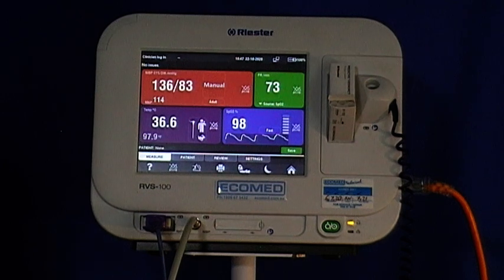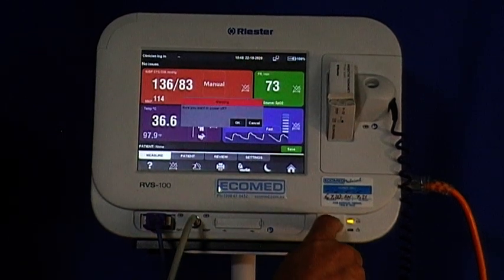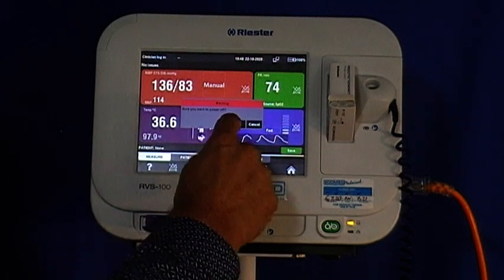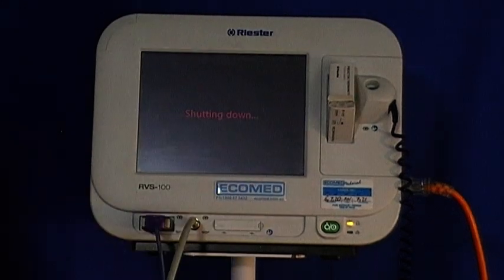Very simple and easy to use. As you can see, all the vital signs are now filled in and easy to read off the screen. If you need to switch the unit off after use, simply press the green button again. It will come up with a message asking if you want to power off, and you press OK and the unit will switch off.